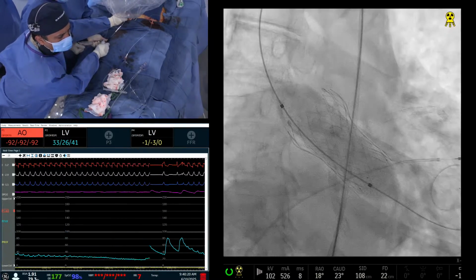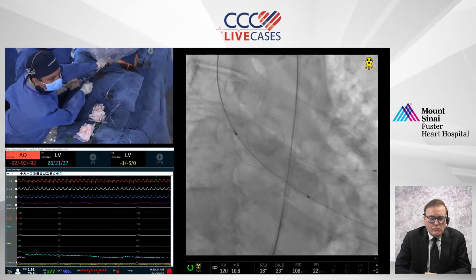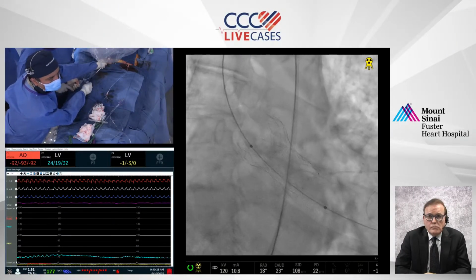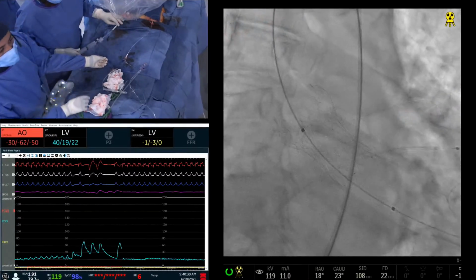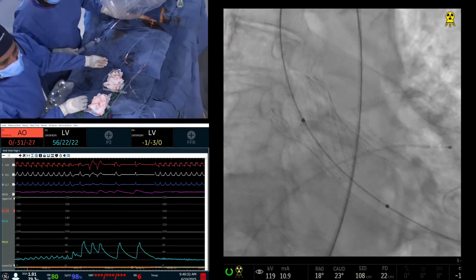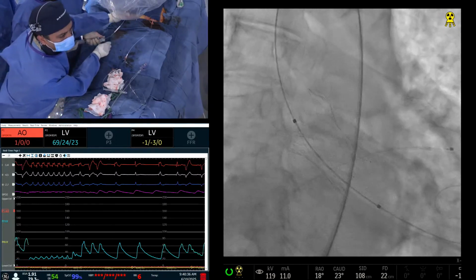Simultaneously, we have another question. Is the valve, balloon, needed further down? Okay, let's recover. Off. Okay, leave it there. One second, let it recover. It could be the balloon is too big also. That's why I moved up. No, we'll do it again. Okay, go again, quick. Hold it.